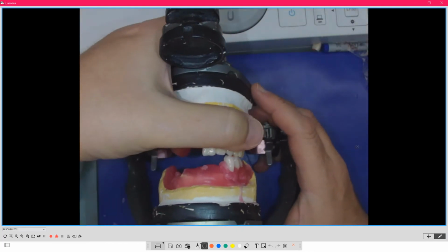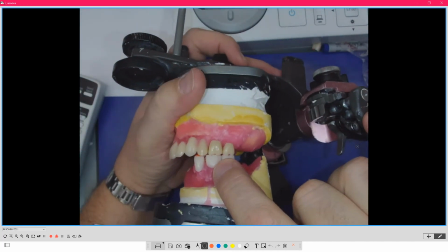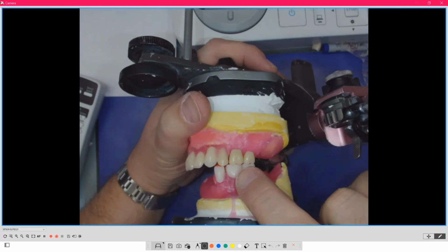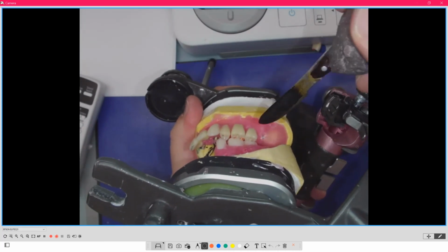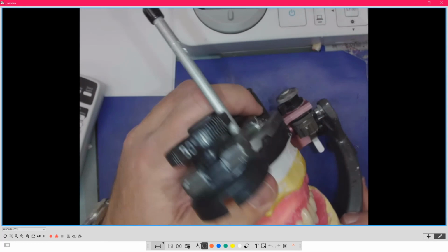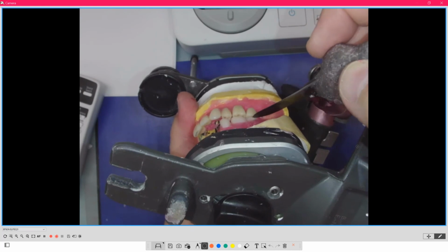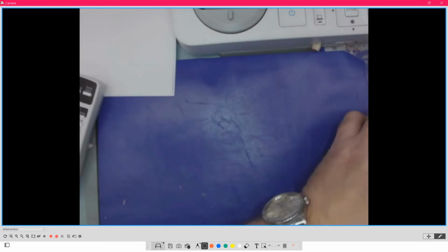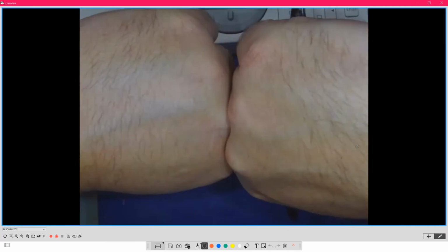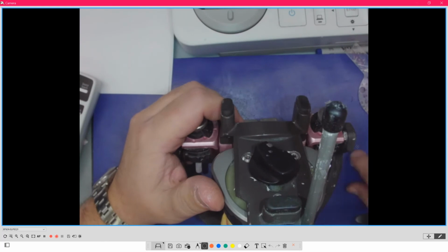So again, behind the lips, it looks the same, yet now I have a little bit more of a traditional type of setup. But again, it's not locked together, but I still have, look, as I hold from that angle, you can see I still have, just a minute, I have to lock it. I still have overjet. So what you're going to see here is that there's little bits of freedom and gapping in there. So it's not knuckle tight. We're used to setting these teeth and looking at it knuckle tight. And I'm here to say, please stop doing that, everybody. Technicians, doctors, everyone that's listening, stop doing that.